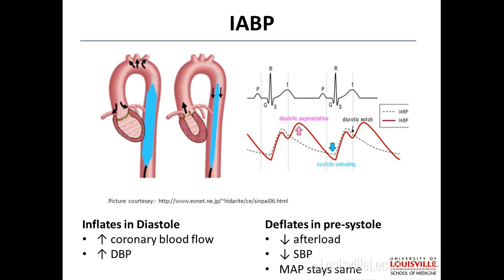Any other questions on this? One other comment, because you'll see these in the CCU and you'll go, oh, there's a monitor, I don't know what to do, and then you'll back away. Well, the way that the balloon pump knows how to inflate is usually based on EKG gating. So we have EKG leads on the patient, and the device times the inflation based upon the EKG because it knows when ventricular systole and diastole are.